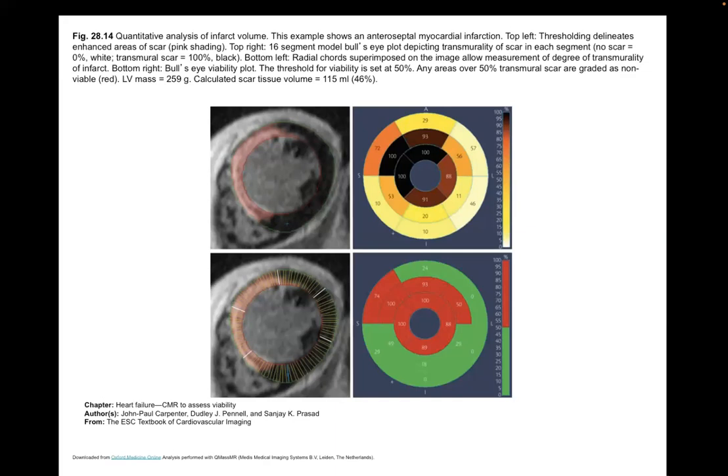But the interesting thing is, if you've had a heart attack, say you had ECG changes, etc., and they get in and fix it and put a stent in, you can go to MR and get one of these pictures and see how much normal tissue do I have left. Am I right on the precipice, like half my heart's gone? Should I really start working out my paperwork? Or is it a small infarct, right?